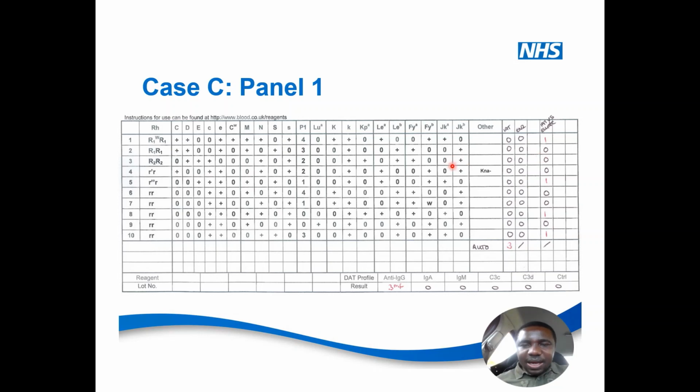Then JKA is positive, negative, negative, negative, that JKA negative, negative, negative. Then you have plus, positive, negative, negative, negative, negative, plus, negative, that JKA, negative, positive. So this matches JKA, okay? But remember, we cannot exclude CW, okay?